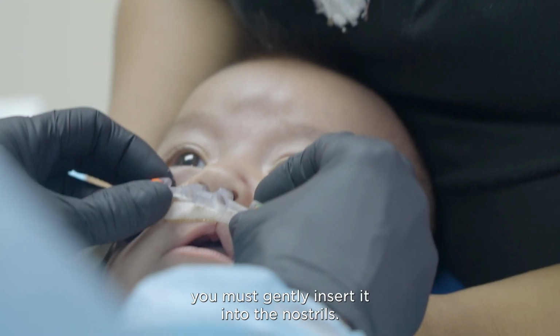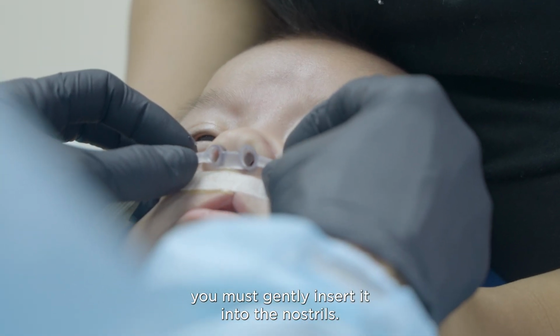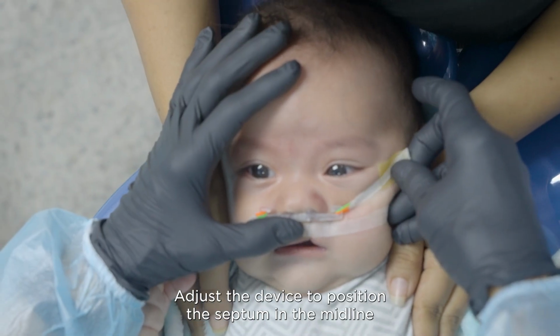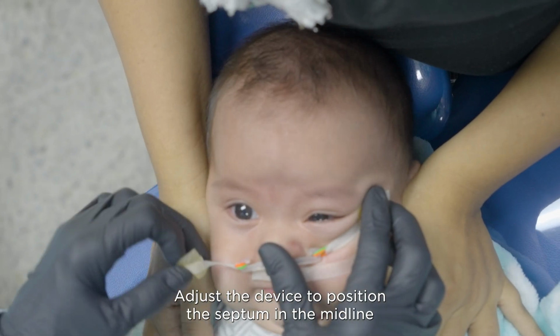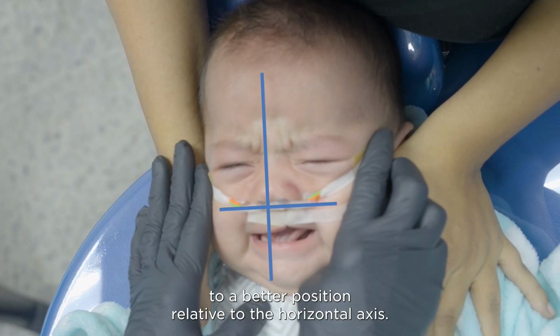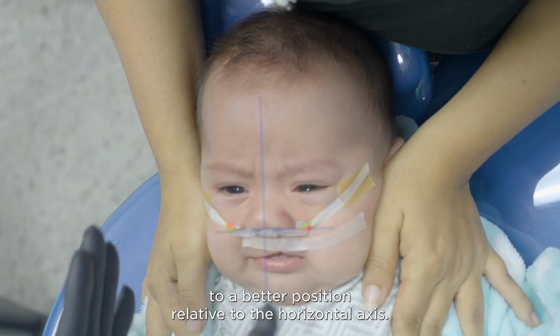To place the device, you must gently insert it into the nostrils. Adjust the device to position the septum in the midline on the vertical axis and elevate the nose on the cleft side to a better position relative to the horizontal axis.